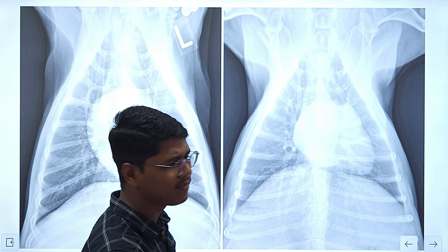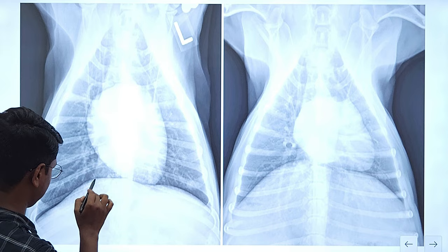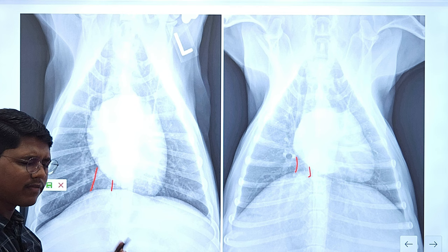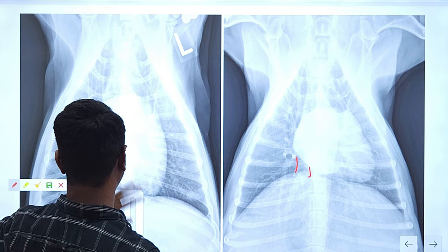The caudal vena cava may not be visible in all dorsal ventral or ventral dorsal views, but in some radiographs you can identify it here. This is the caudal vena cava.